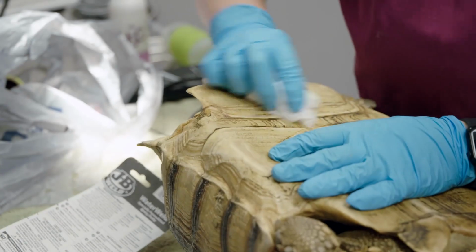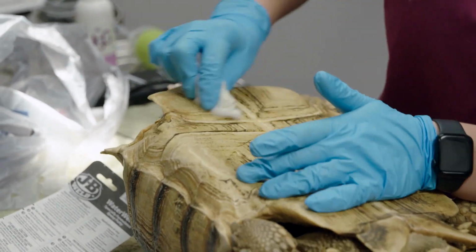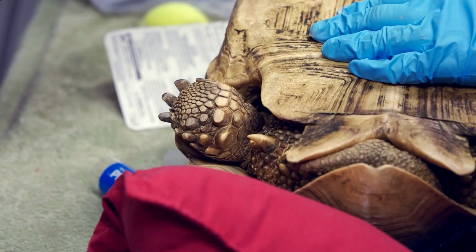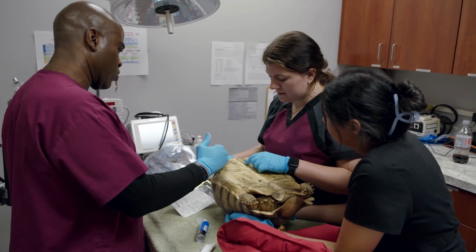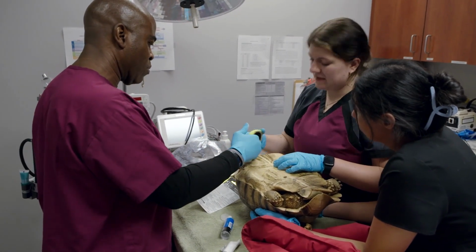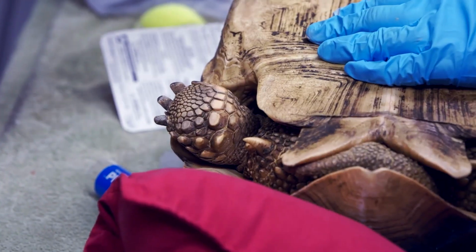So now we're about to do the prosthesis so that we can give some elevation to that area now that she doesn't have a limb, to help with her mobility, prevent damage to the shell, and help prevent injury and pain. So the arm will come here, so I'm thinking like right there. Because when I've seen the wheels, they've all been here. Like right there. Okay.